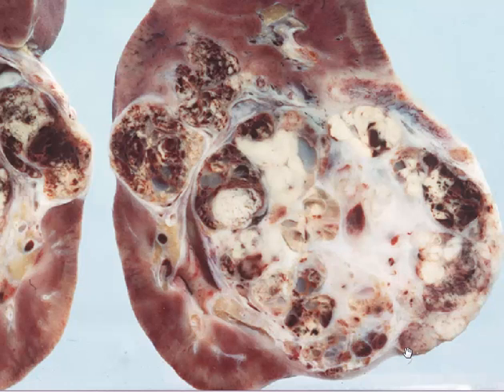This is the classical appearance of a renal cell carcinoma, and it highlights the fact that the process of neoplasia occurring here is also associated with other pathological processes, in this case healing or scarring, because of the formation of scar tissue, but also, not easily seen here, the process of necrosis, where the tumour nodules, because of increased tissue pressure centrally within the tumour, die. Can't easily see that, but they've been replaced by scar tissue after their death.